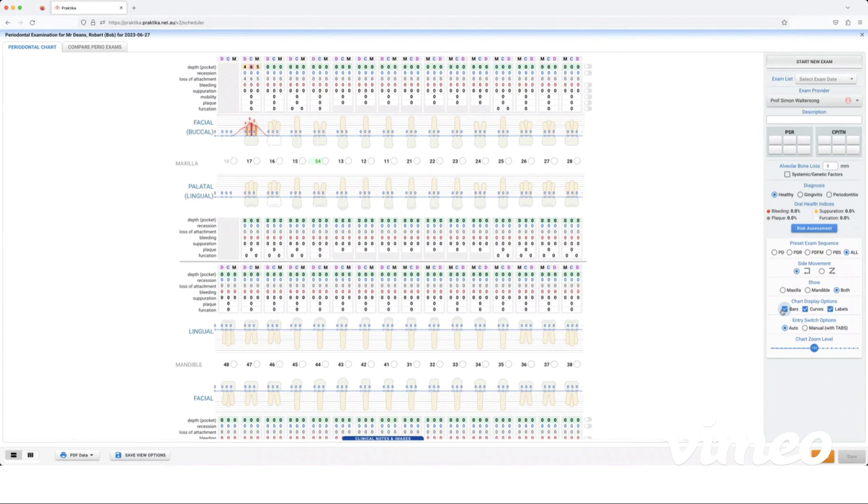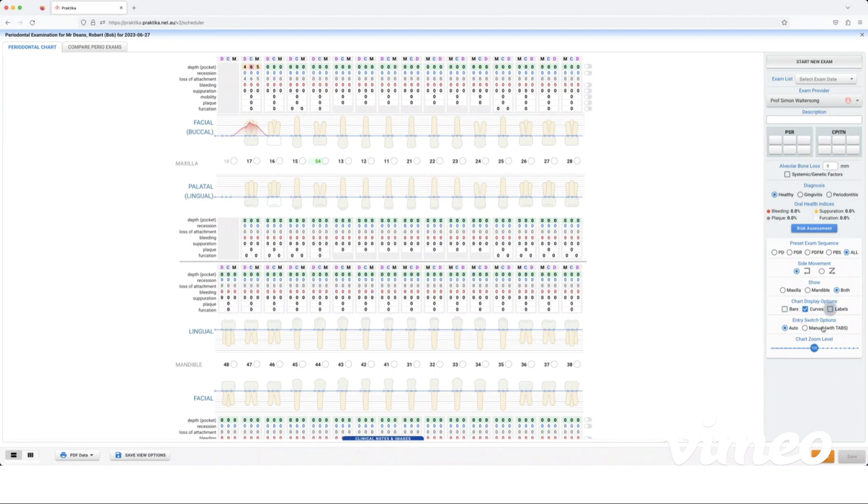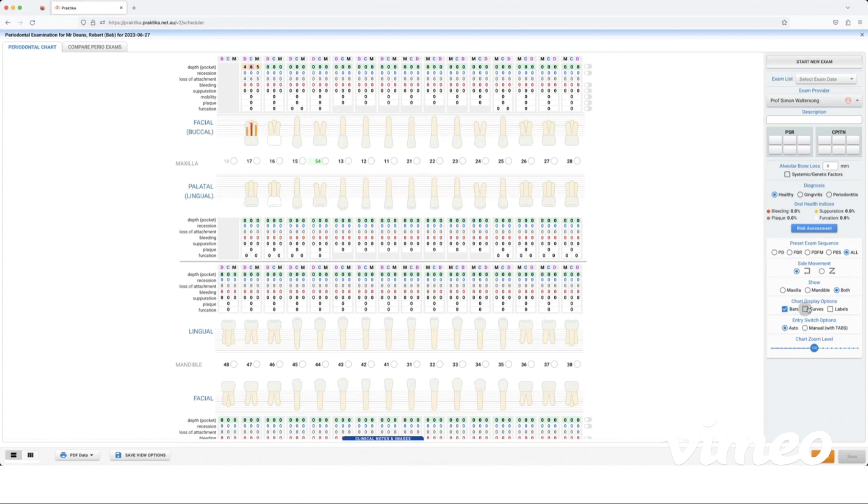I don't recommend having all three of these options ticked because the more data the chart has to load, the slower your perio chart is going to be. So just have your one preference turned on. If it's curves you can untick the others and just leave curves ticked, or if it's bars just tick bars and untick the others.